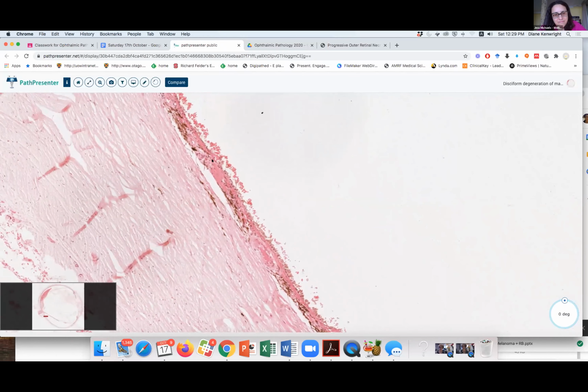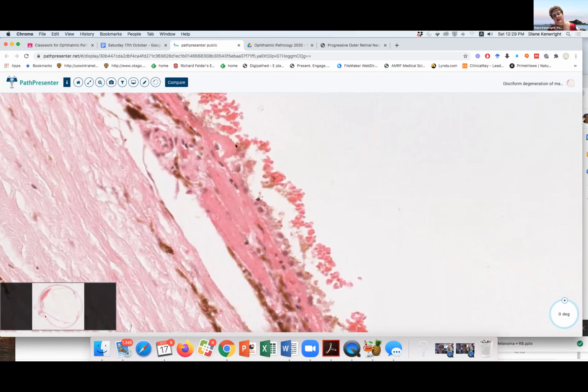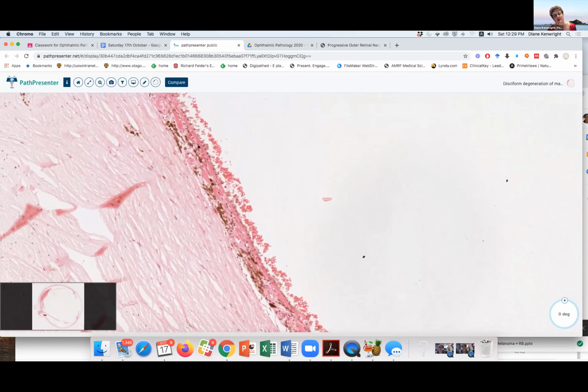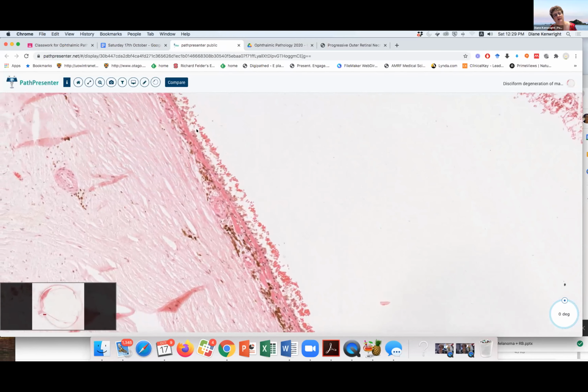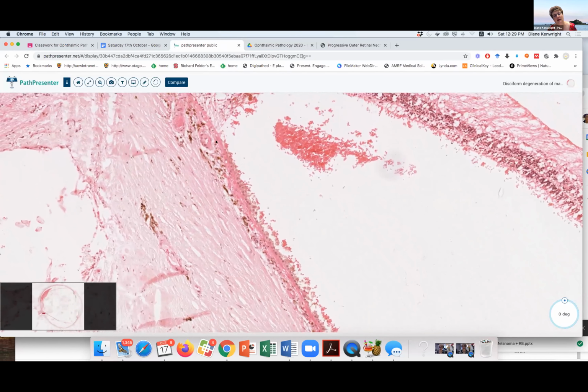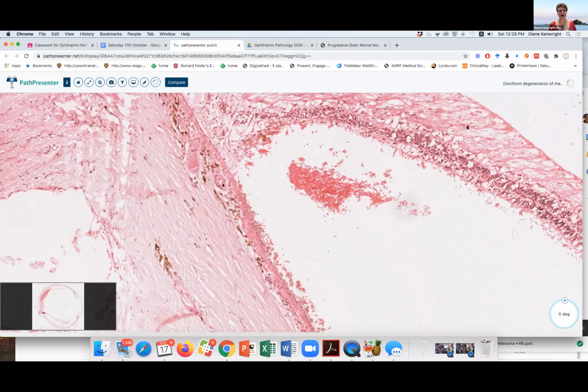Is this another one? Maybe this is another one. Maybe I'm getting my eye into them now. There we go. A few drusen. Pretty subtle though. Okay. Good. All right. Next case.